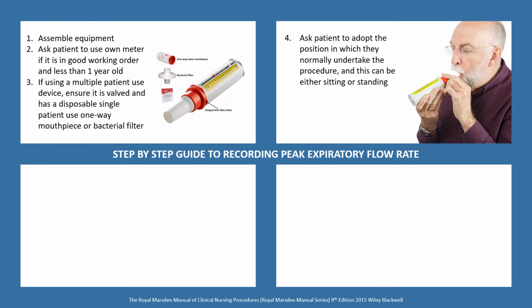If you're using it for multi-patient use within the surgery, make sure that you use an antibacterial filter here, one of these. Ask your patient to stand up or sit down, whichever position they normally adopt to perform the test. It's best to ask them to do that. Ideal world, it's better if they're standing.